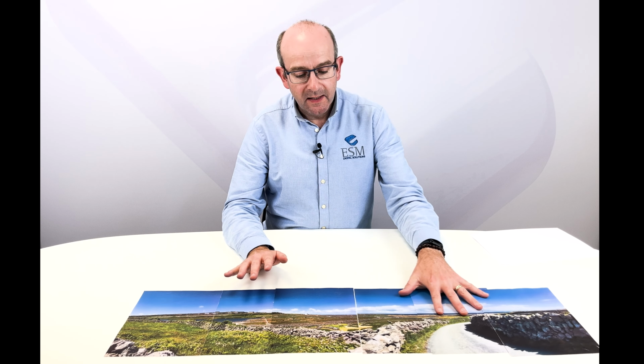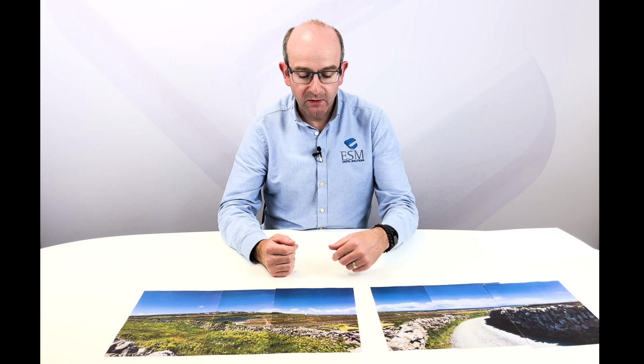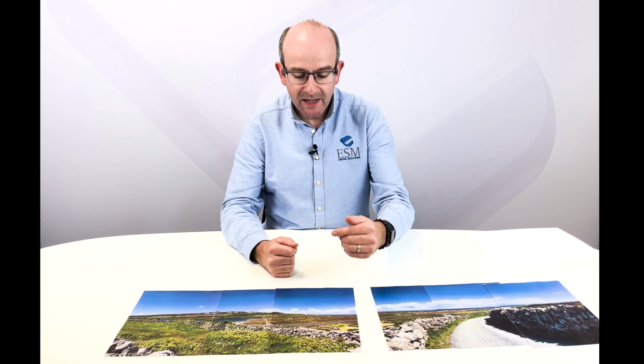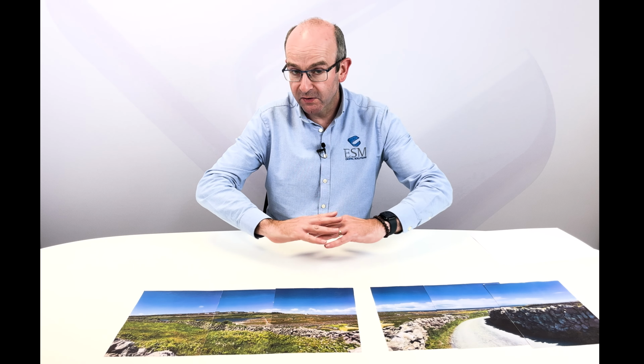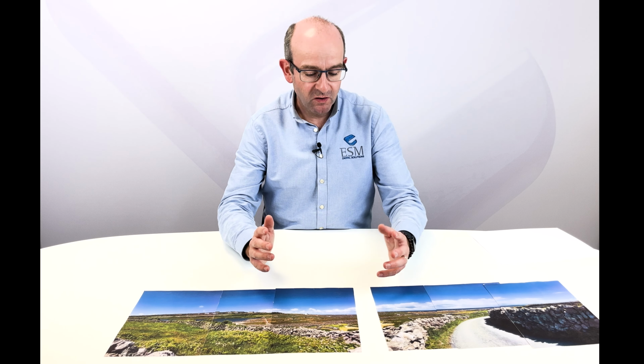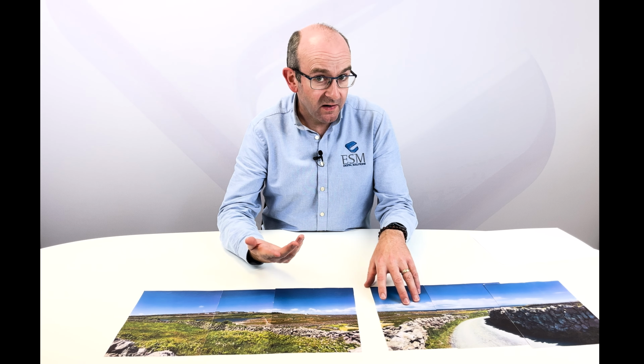Now let's look at a stitching error. Again, the software is looking at the big picture. It's looking at all the details it has, and it's trying to stitch everything together. We've got lots of detail here, but imagine we only had blue sky and green field, and it was a straight line between the two, and we had no clouds. It would be very difficult for us to get that alignment correct. That's extreme, but it would be extremely difficult for us to do reliably. But again, bearing in mind, in some dental situations, we're scanning where the detail is very, very vague, and therefore it's very hard for the software to stitch everything together, or the software might just need an extra little bit of time to do that stitching.